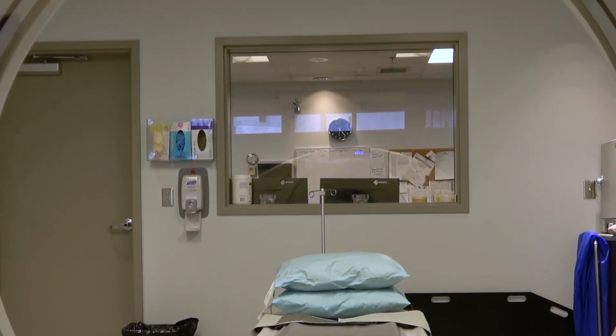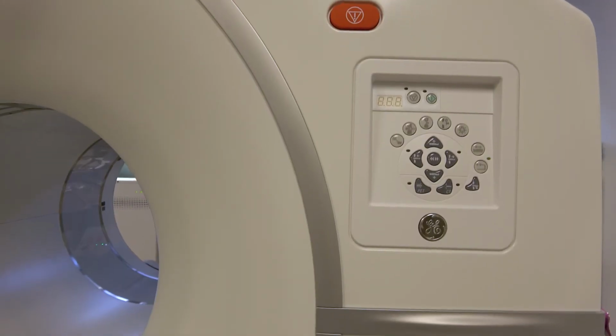The control room's back in the back there, and that's where the technologists run the scanner, so they make sure that it's getting all the images that it needs and that we've gotten all the data that we want. So a CT works because you've got an X-ray tube on one side of the ring and you've got a detector on the other side of the ring, and that whole structure moves. So in order to generate a CT scan, you have to actually rotate the whole assembly around the patient. And you do a whole bunch of complicated math, and you can generate a 3D image of what's going on inside the patient. With the PET scanner, it's actually fixed.